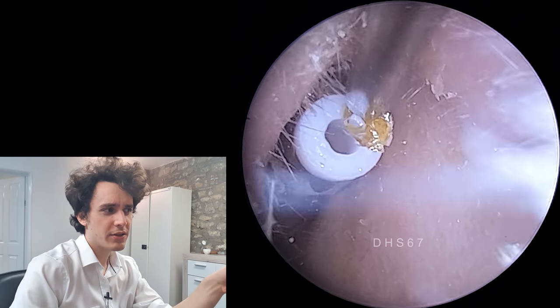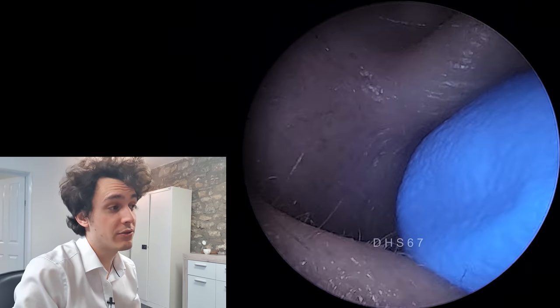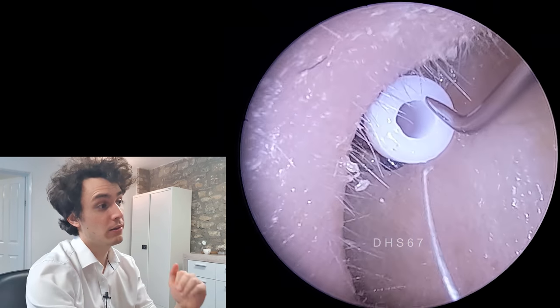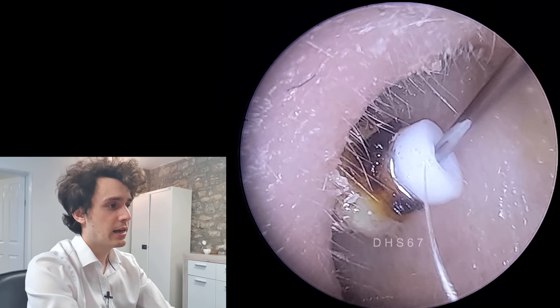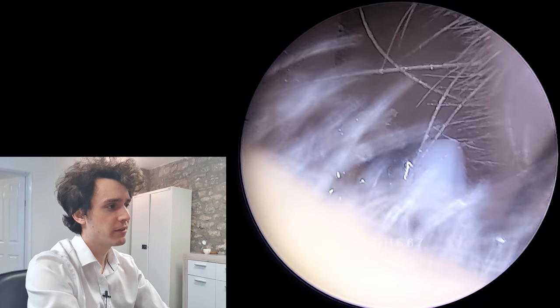You can just about see it on the right-hand side, and that baffle is basically to stop it from being extruded very quickly from the eardrum. So we'll go back in here and I'll fish it out with a Cawthorn hook, which is this metal instrument you're seeing here. Unfortunately I do end up dropping it, so a little bit of faffing will ensue.